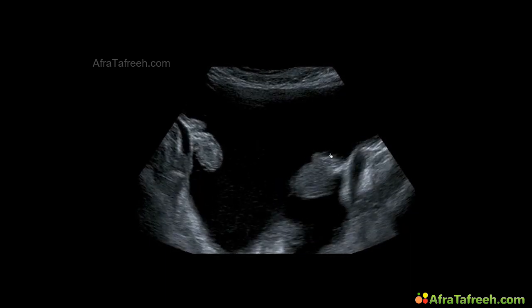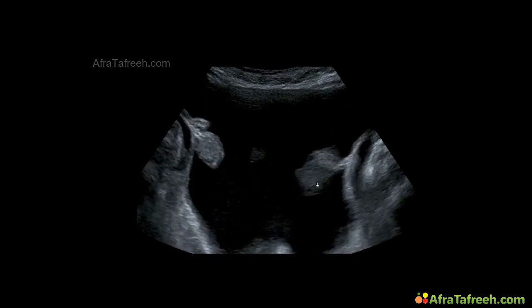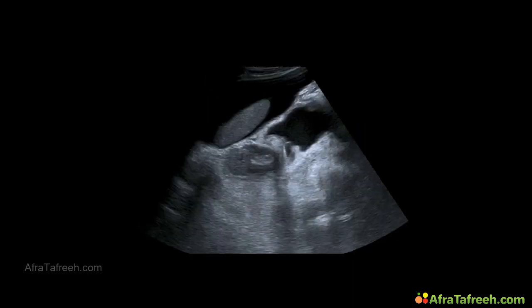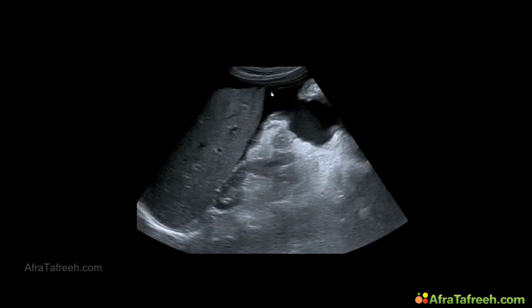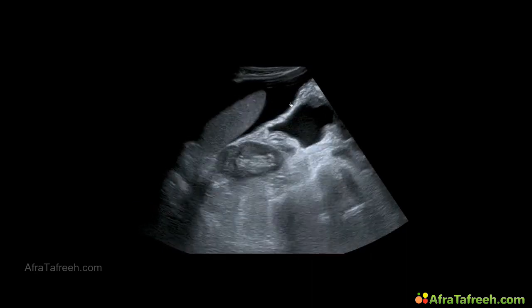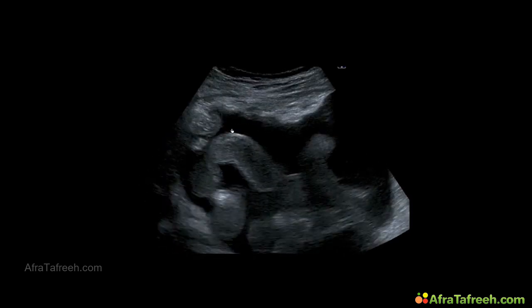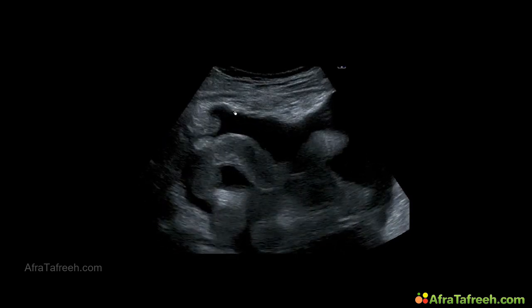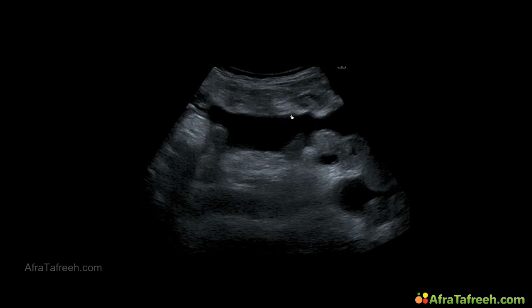The left ovary is quite greater than the right one, but it's not clearly seen whether the tumor arises from the left or the right side. Also, ascites in the right upper quadrant around the liver. And once again, metastasis in the peritoneum and at the abdominal wall of this female patient over here.